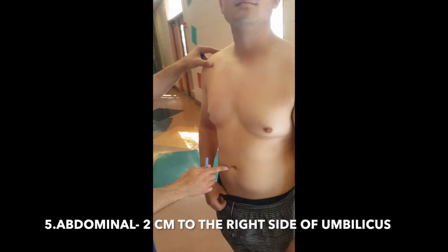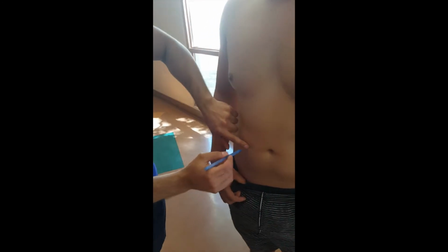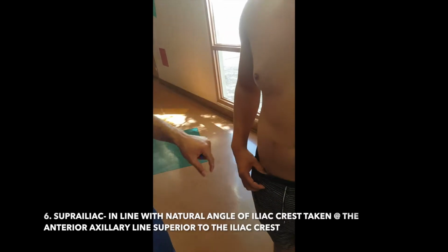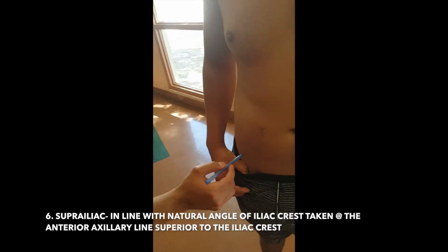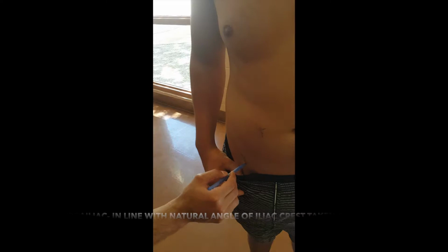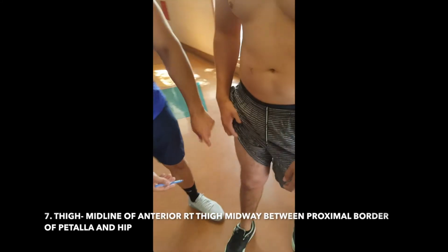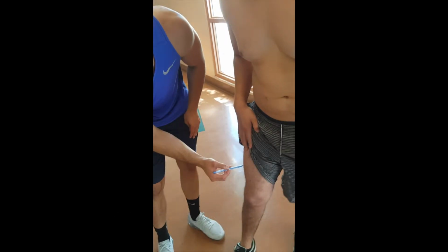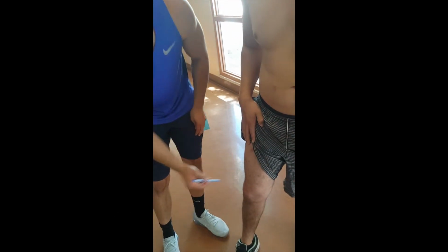Next will be our abdominal measurement, marked by 2 centimeters to the right of the umbilicus, and our suprailiac, which will be in line with the natural angle of the iliac crest taken at the anterior axillary line superior to the iliac crest. Our last measurement will incorporate the midline of the anterior thigh midway between the patella and hip.